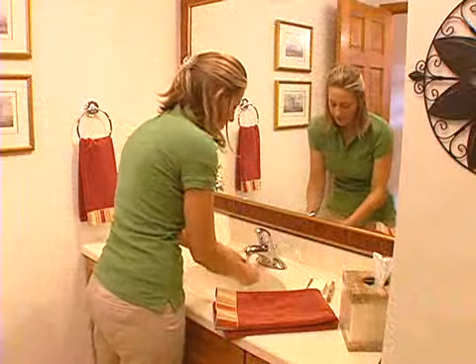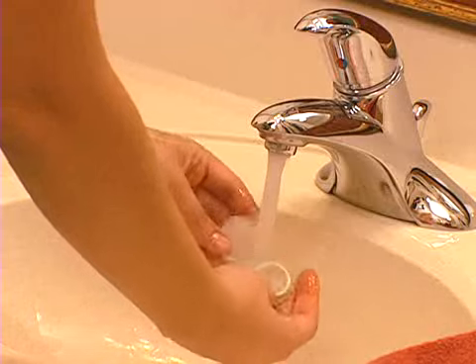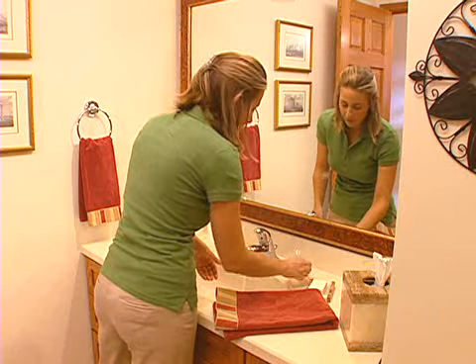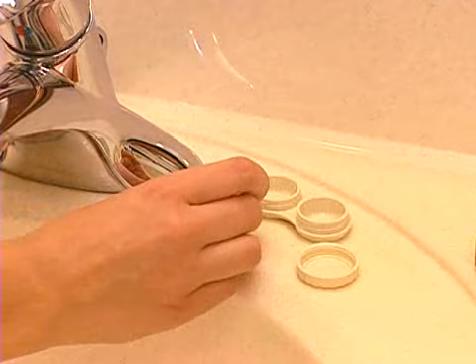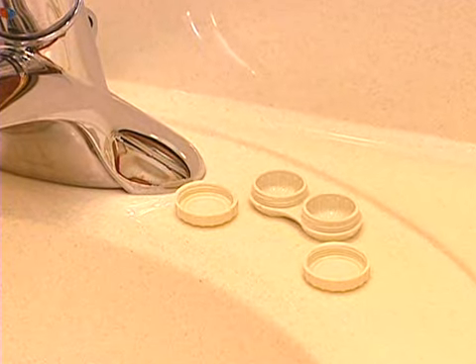The case itself can be the source of bacteria, so it needs to be cared for as well. After removing your GP lenses from the case, be certain to rinse it with hot tap water and allow it to air dry. The case should also be replaced monthly.